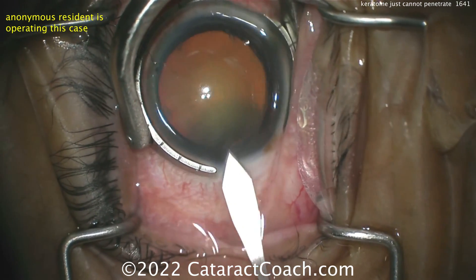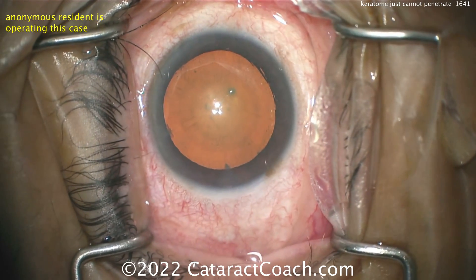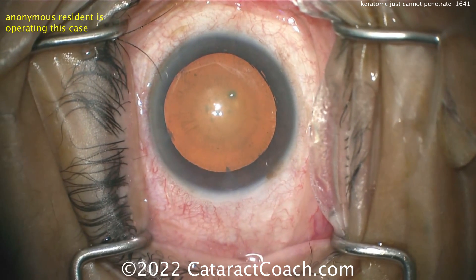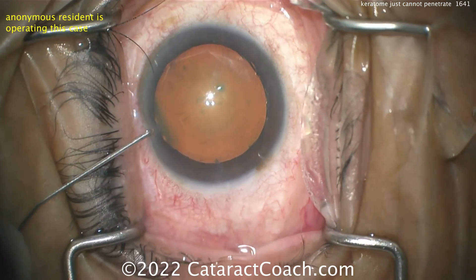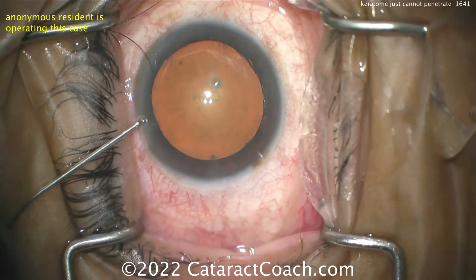I think the technique's okay. I think the problem is the blade itself. A lot of times the scrub tech may open those blades and put it on the OR tray, on the Mayo stand, and that tip hits the table and gets dull. Or maybe it's a keratome you've used for multiple surgeries already — it's already too dull. It needs to be replaced.